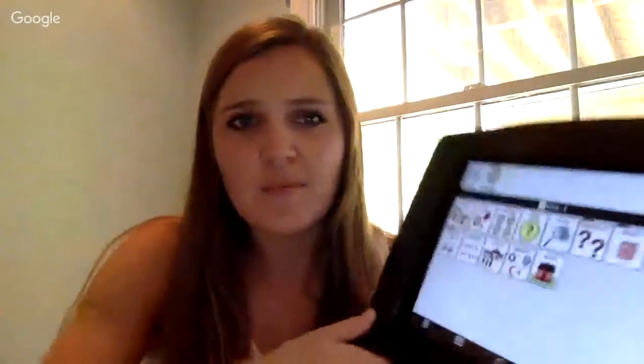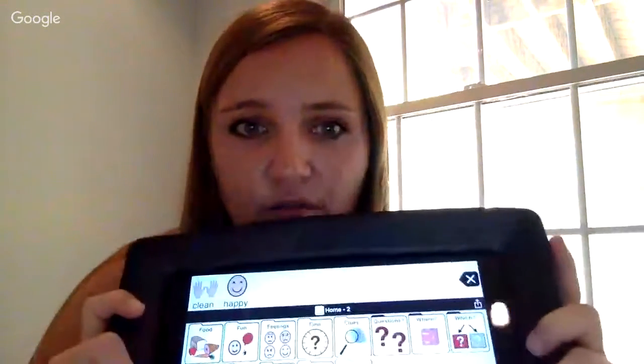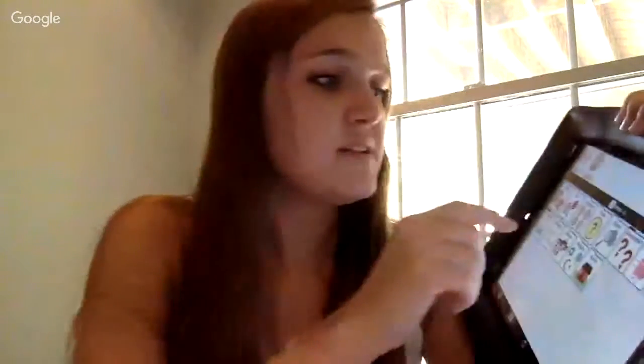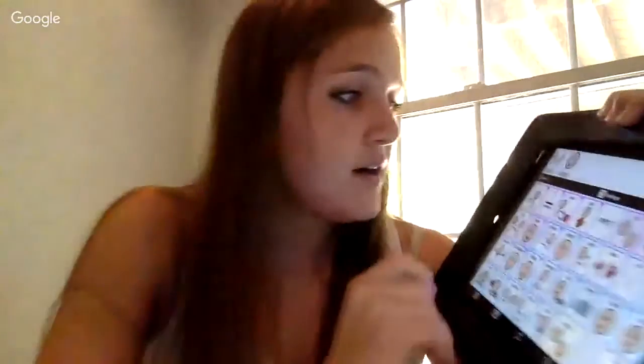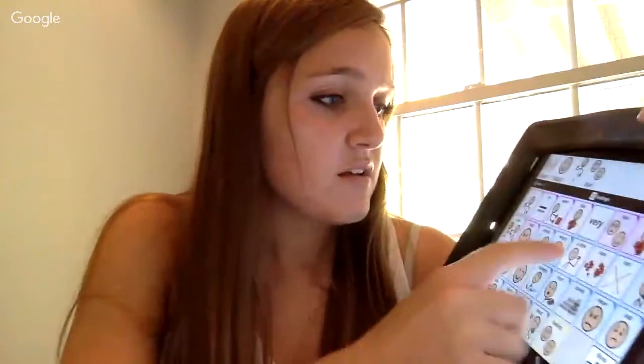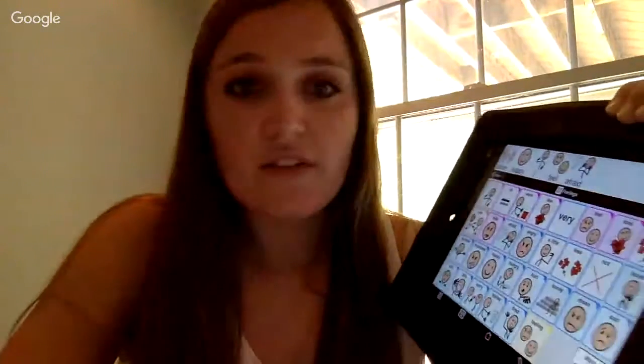That's another cool thing about having a voice output communicative aid, is that you can add to conversations. So you can say, like, I feel angry. I feel afraid. You can add things, you can comment on things. It really just gives a lot more conversation skills and conversation aids, and then they can make friends easier, and they can talk to people.